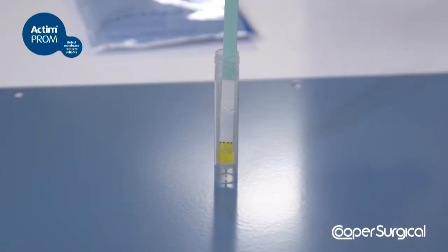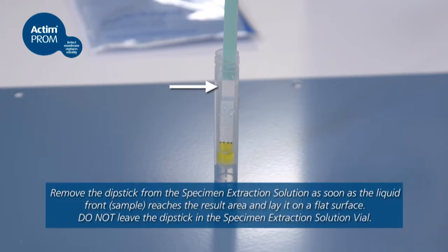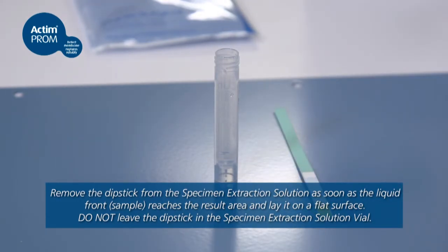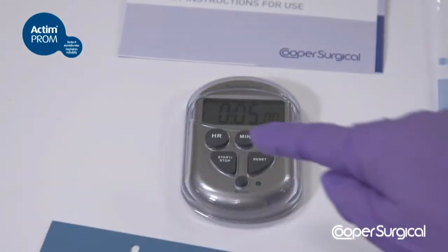Place the yellow tip of the dipstick into the specimen extraction solution and hold it there until you see the liquid front enter the result area. Remove the dipstick from the specimen extraction solution tube and place it in a horizontal position. Start the timer.